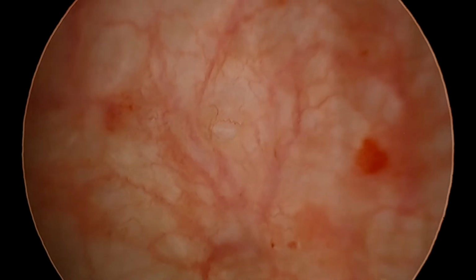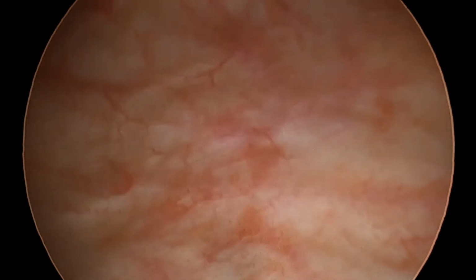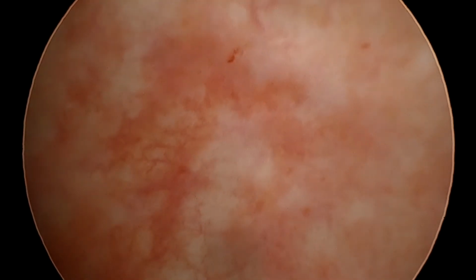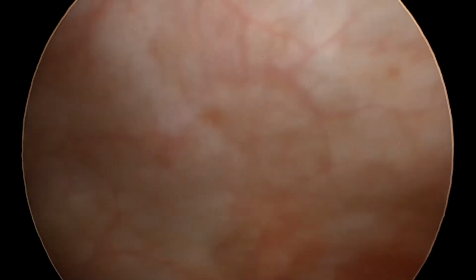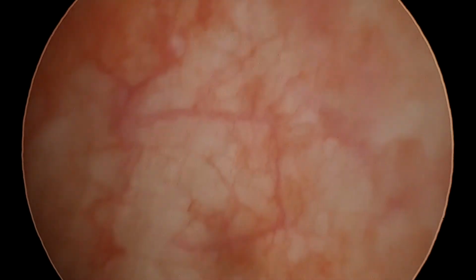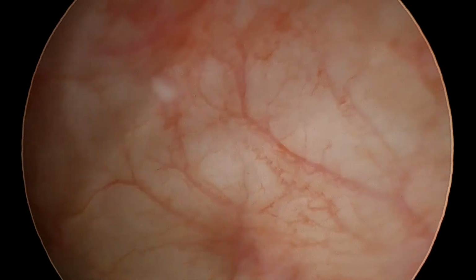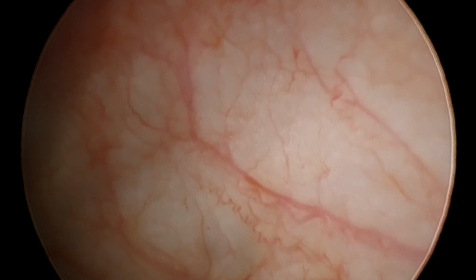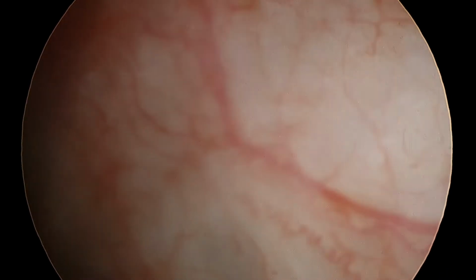Diagnostic cystoscopy after laparoscopic hysterectomy is an invaluable tool which helps in ruling out almost 80 to 90% of injuries to the bladder and ureters. A clear stream of urine coming out from the ureteric orifices rules out most of the damage done to the ureters. We perform routine diagnostic cystoscopy at the end of most of our difficult laparoscopic procedures to rule out any inadvertent damage which may have occurred to the urinary system.